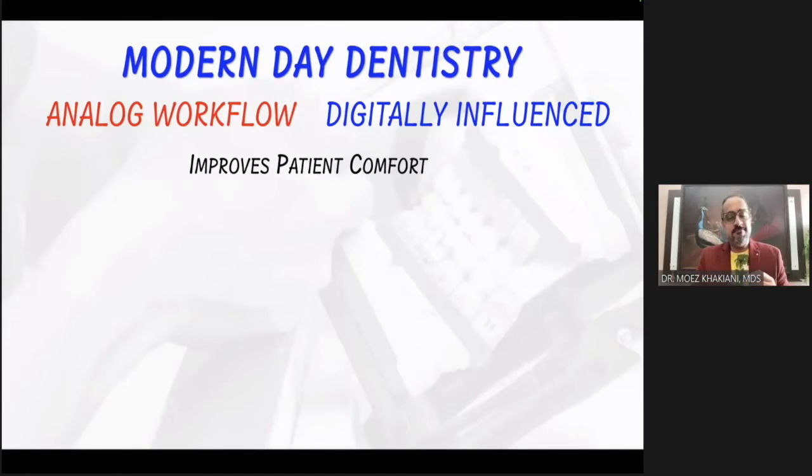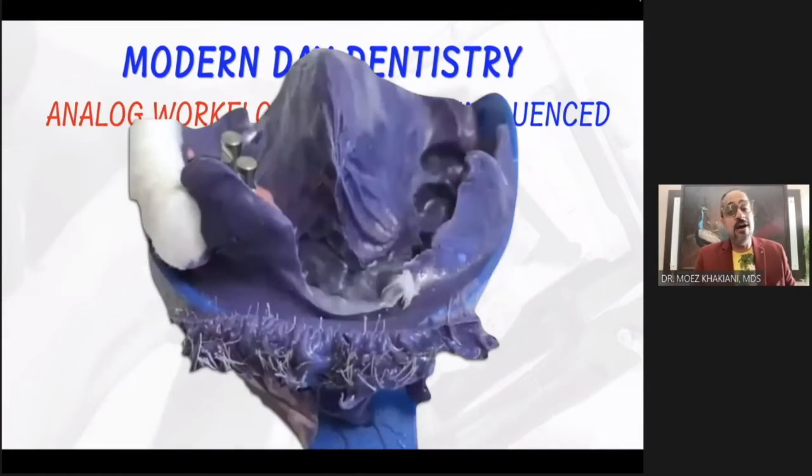हम सब पे बीत चुकी है ये. हम impression tray मुंह में डाले हैं, impression material मुंह में गया है, patient starts gagging. It's not uncommon to find toppings on our impressions, especially if you're making one immediately after lunch, which I'm guessing you are enjoying as we speak.